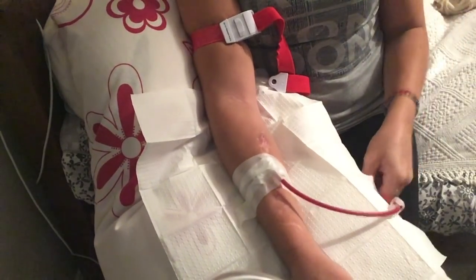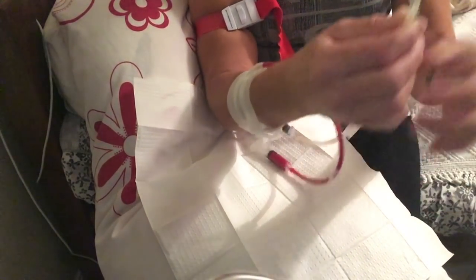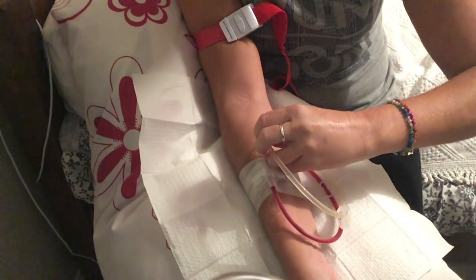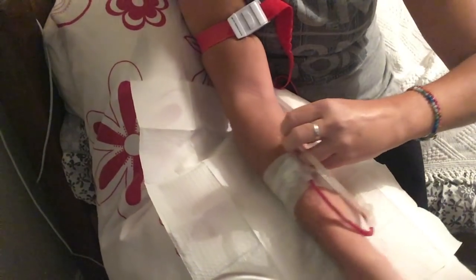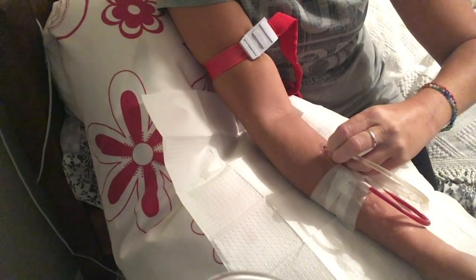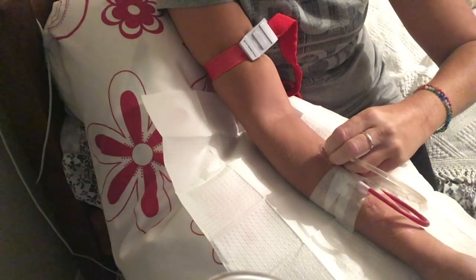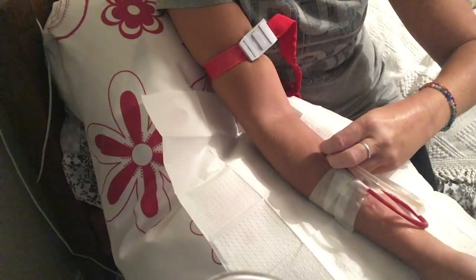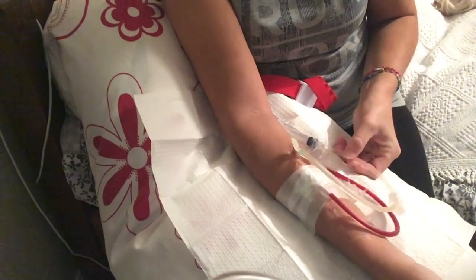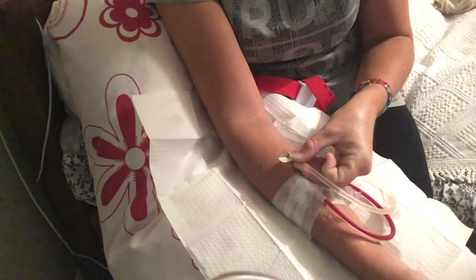I put the tourniquet back on, tighten that up again, and put the second needle in. The same thing — I want the flat side of it first. It's much better to needle yourself because you can feel exactly what you're doing on the inside, and take it as slow and as gently as you need. It's much better for your fistula as well. So that one's in — I'm just going to turn that the other way up.